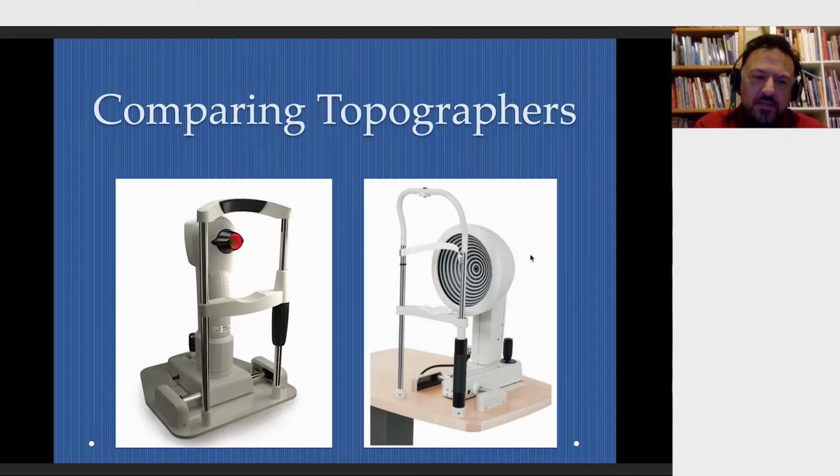So in our practice, because we have the luxury of having both items, the Keratograph serves as our main tool for corneal imaging on the regular cornea patients. What do I mean by that? When we have a patient who wants to wear soft contact lenses, disposable lenses, basic toric RGPs, orthokeratology, these are all patients who, while they need correction, have normal corneal shape. And so for those individuals, we use our Keratograph pretty heavily.